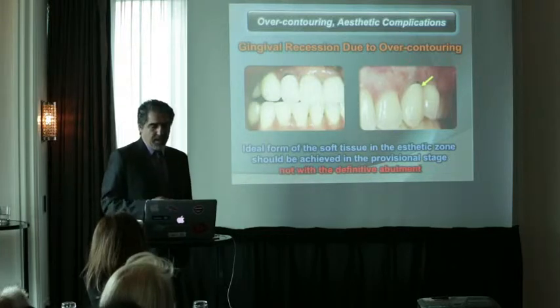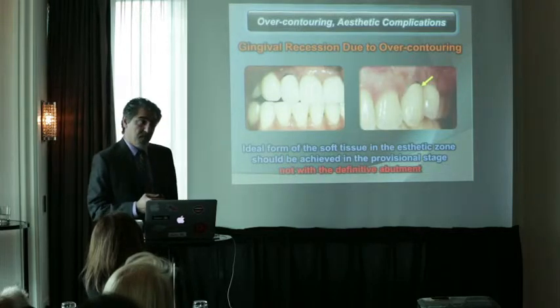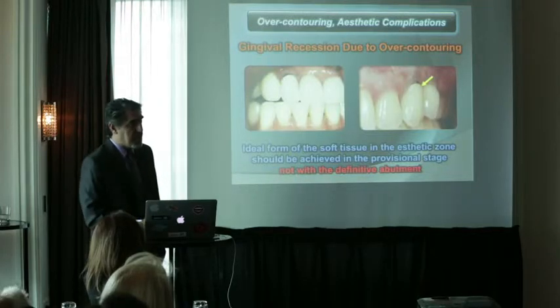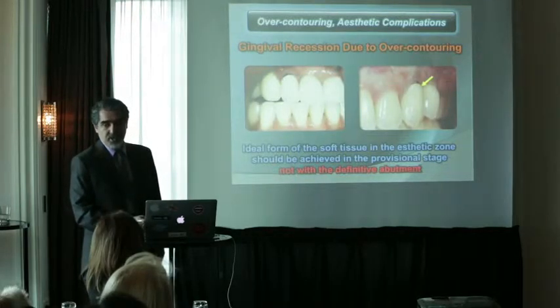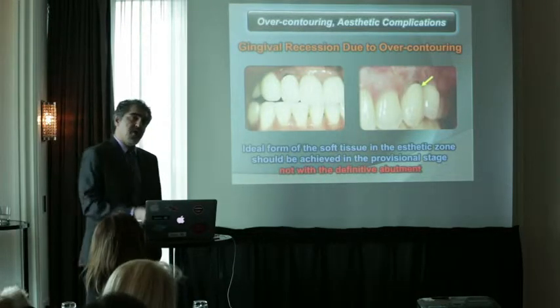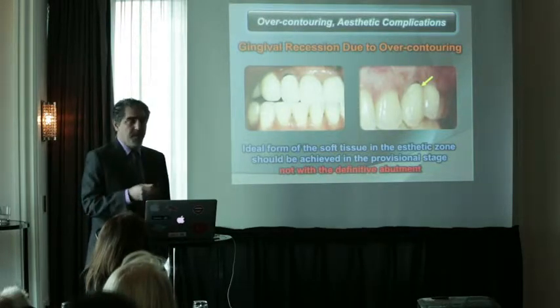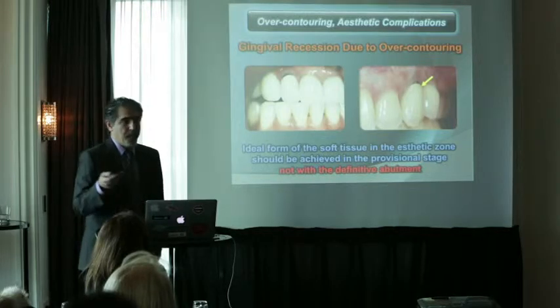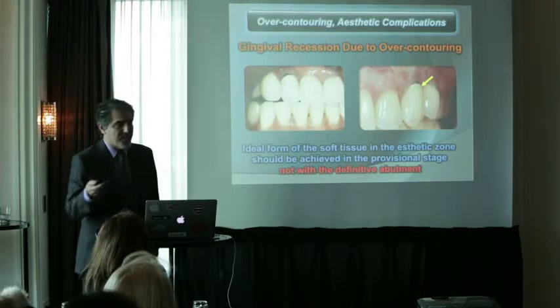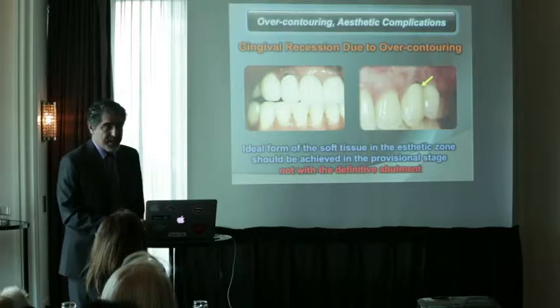And usually the best way of developing a good emergence profile for the technicians is using a good provisional stage, and in most cases we don't have the luxury of doing that in private practice. It's very difficult to charge the patient for the temporary, leaving the patient on temporary for 6 months. I'm doing it day to day. I'm working both in private practice and in the school. I know that there are different expectations, and patients in many cases wouldn't accept that.